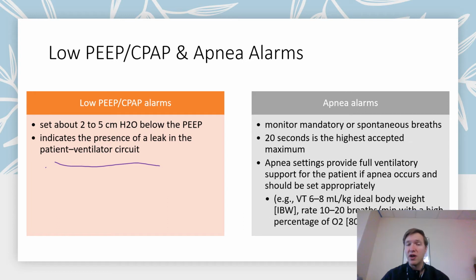The FiO2, a lot of times they'll have you use 100% in most policies. Other times you could use the same FiO2 the patient's currently on, or 10% above. I've seen that in NICUs where they'll just do a 10% above for those patients. So obviously pay attention to those protocols.